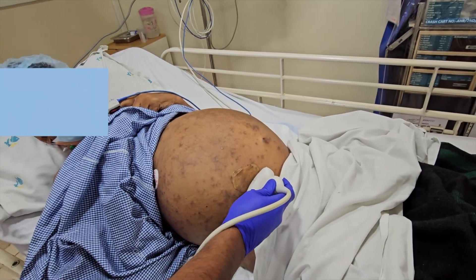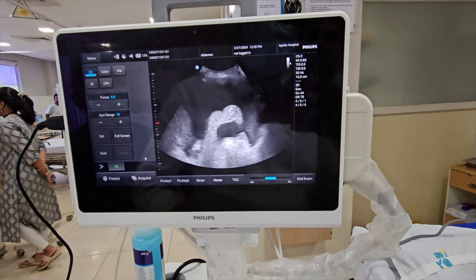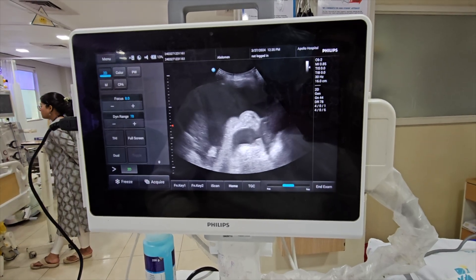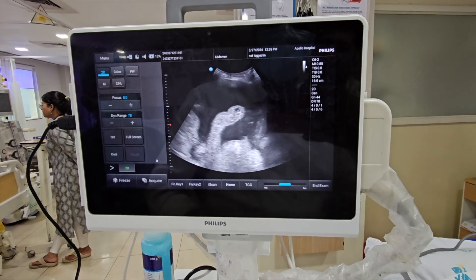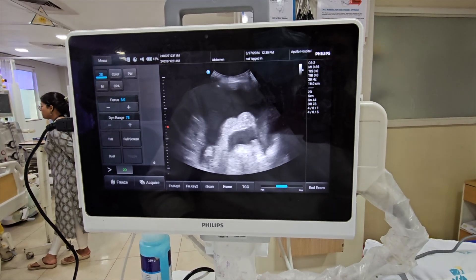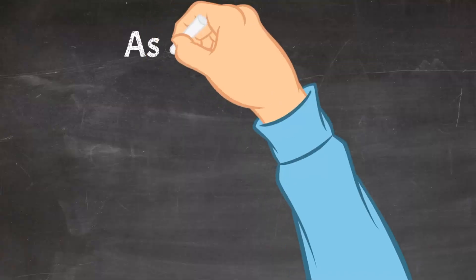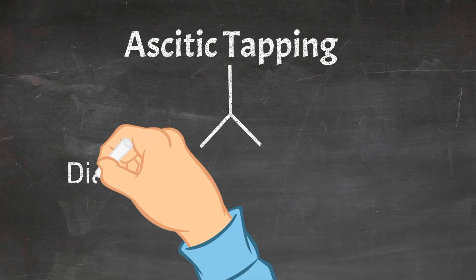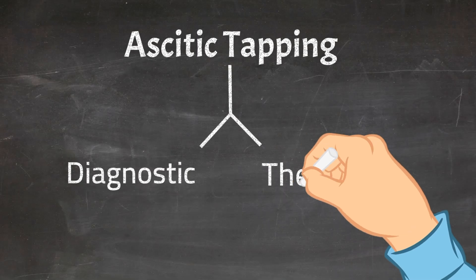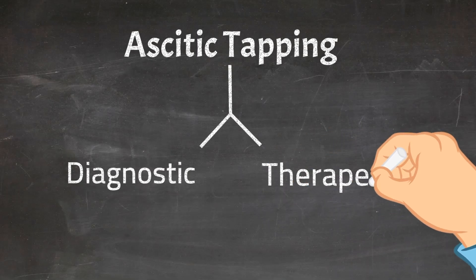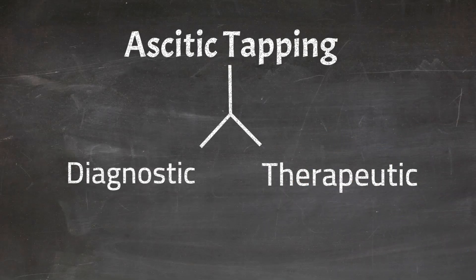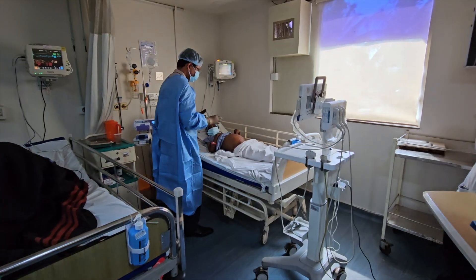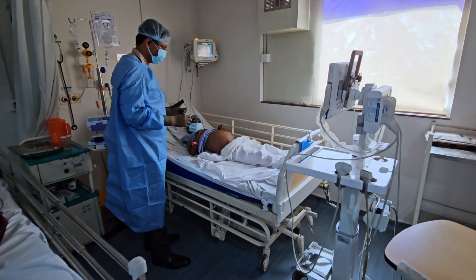Ultrasound helps in quantifying the amount of fluid collection, and thus the ascitic tapping is planned accordingly. The procedure is done under universal sterile precautions.